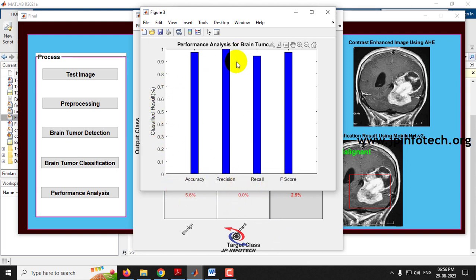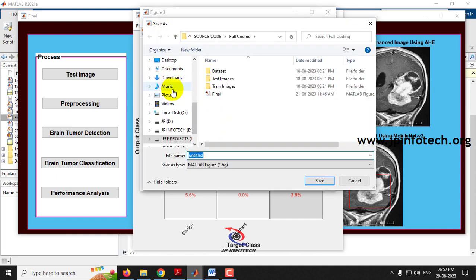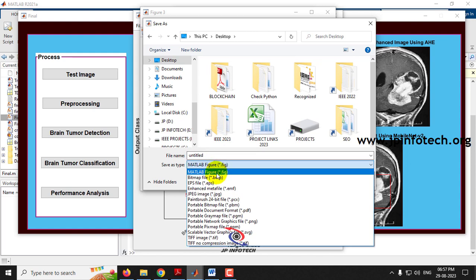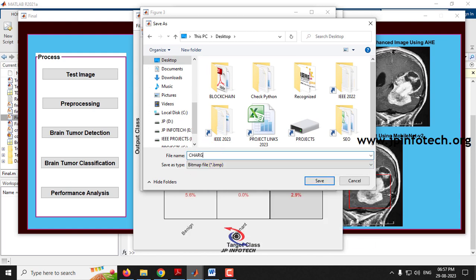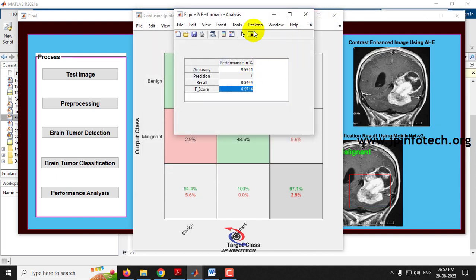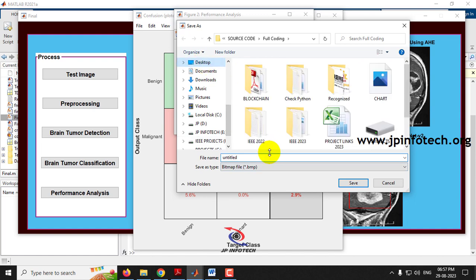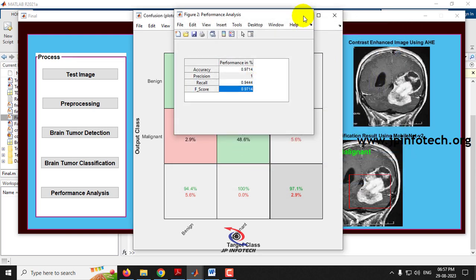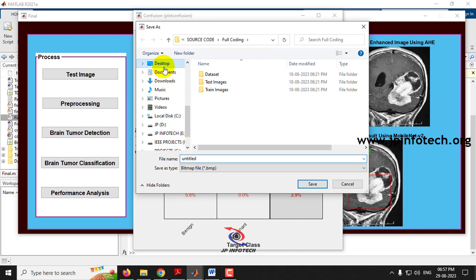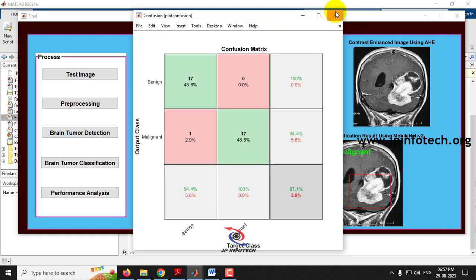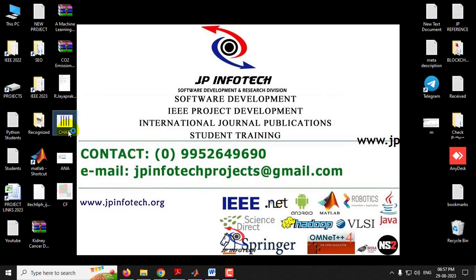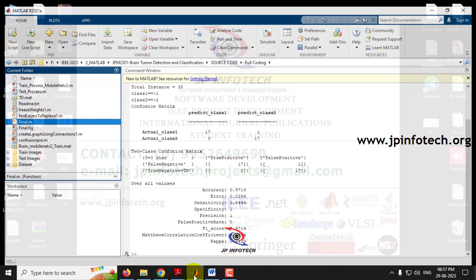A chart displaying performance analysis with accuracy, precision, and F-score values is also shown. You can save these results — for example, save the chart as a BMP image, save the performance analysis, and save the confusion matrix to your desktop. The exported chart, analysis, and confusion matrix are then visible.